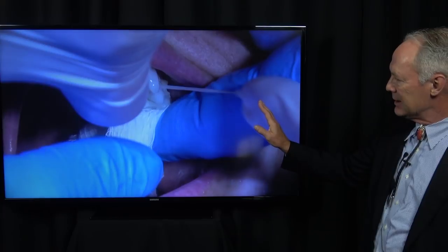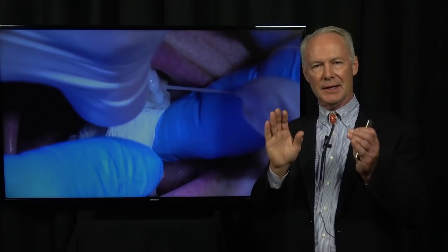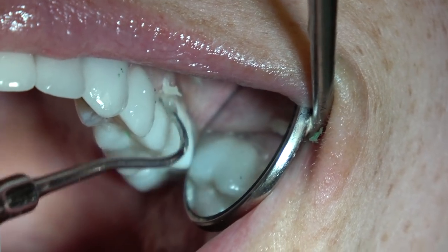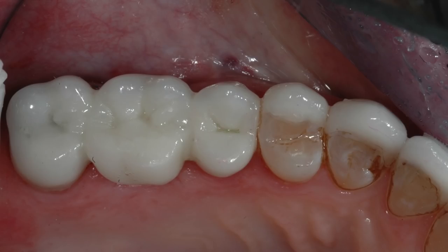Before the cement sets up, floss — but do not remove the excess cement. Only floss the interproximal contact so the excess cement does not set up in the contact, as that's hard to remove. Do not remove the excess cement around the margins until the cement has initial set — not rock hard, but initial set — because you want it to peel off, not wipe off. See, this is initial set: it's peeling off, we're starting to get the cement off the tooth.